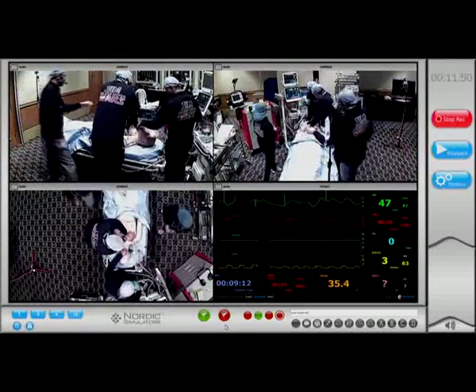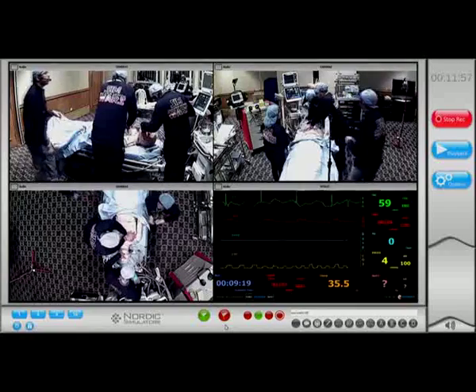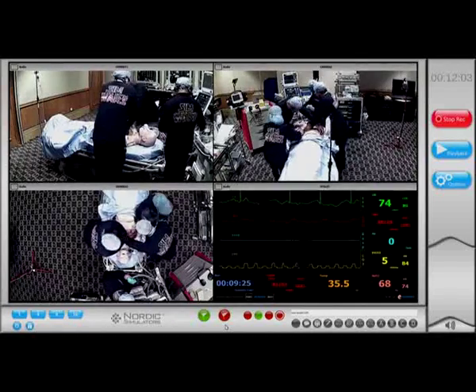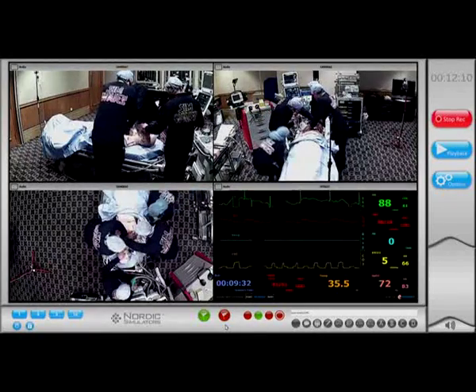Okay. Another chest tube we have. We'll put another chest tube on the other side. We'll auscultate for air entry, ventilate now, Laji. We'll prepare another chest tube. Continue, Ahmed. I'm not able to ventilate, sir. Laji, you are ventilating? There is an audible leak.